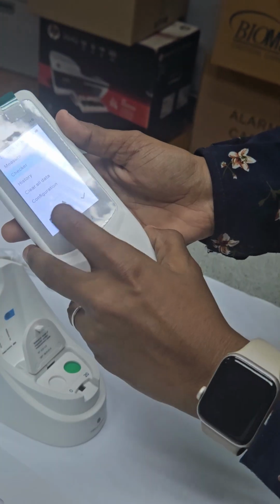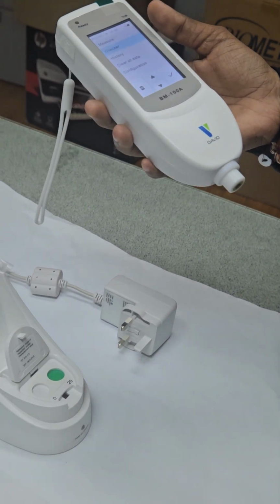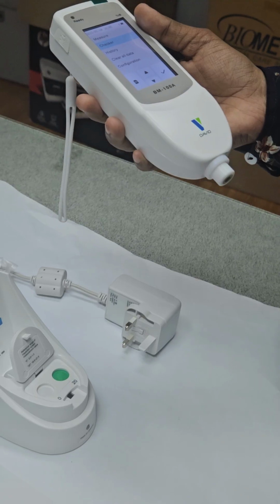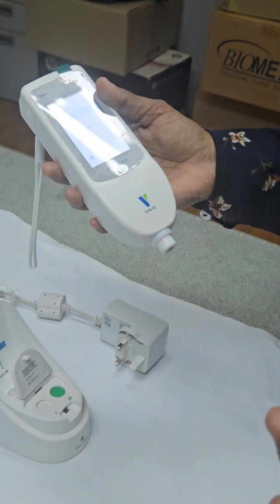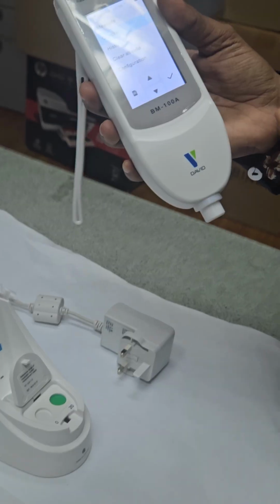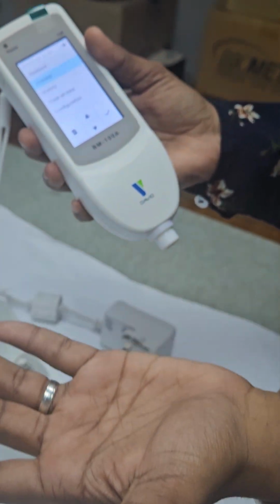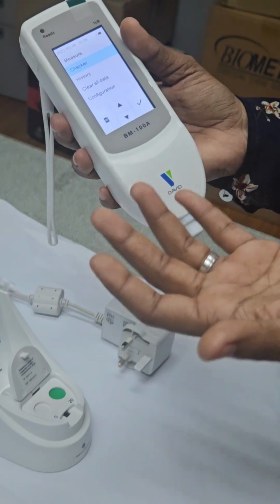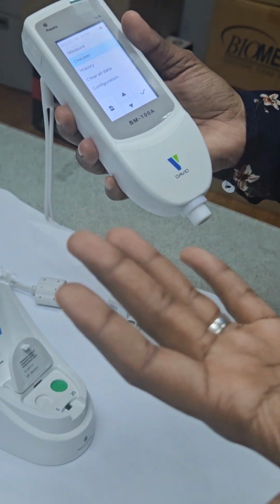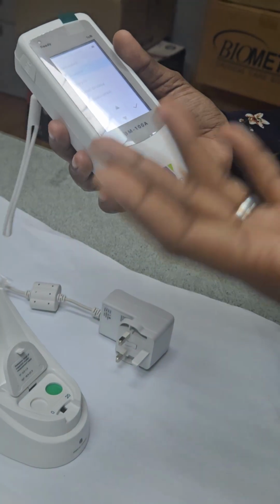Okay. So after the treatment, they do a check again. Yeah. So you do one before, one after, or what is your recommendation? Okay, let's say one before. If the reading is within the normal range when they use this, they won't proceed to the blood test. If it's more than the normal range, then they will proceed to the blood test for documentation purposes and for more accuracy.